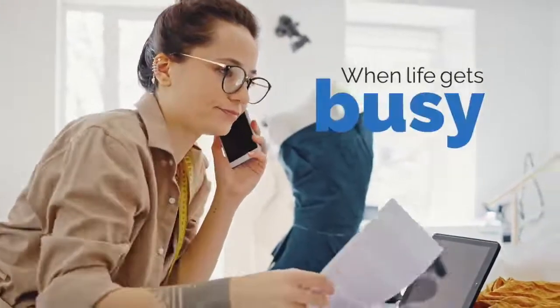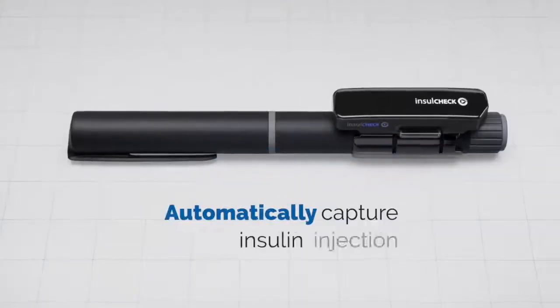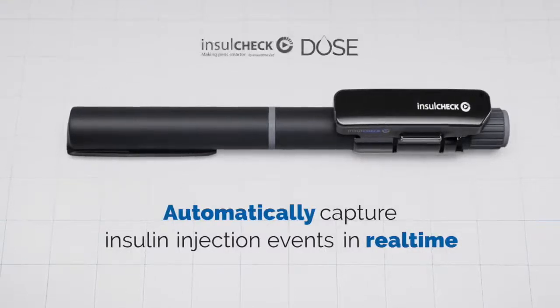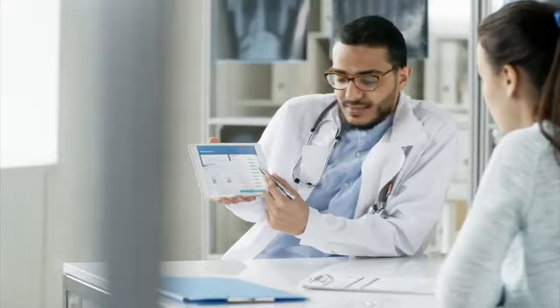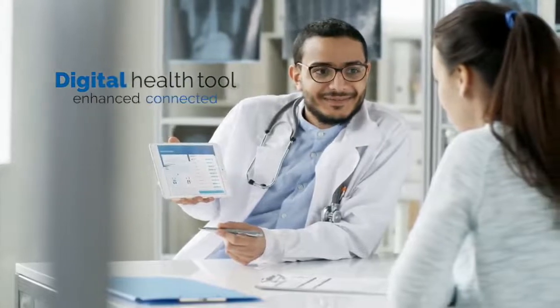When life gets busy, simplify diabetes management by automatically capturing insulin injection events in real time with InsulCheckDose. Once integrated with a diabetes management app, InsulCheckDose transforms into a digital health tool for enhanced connected care.